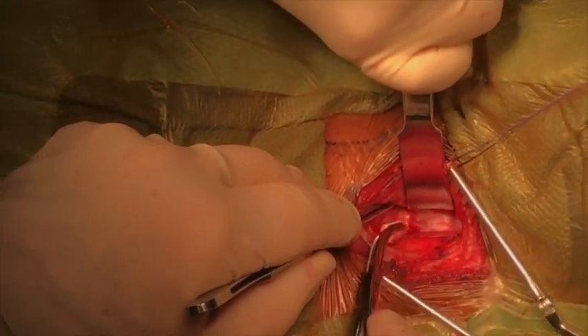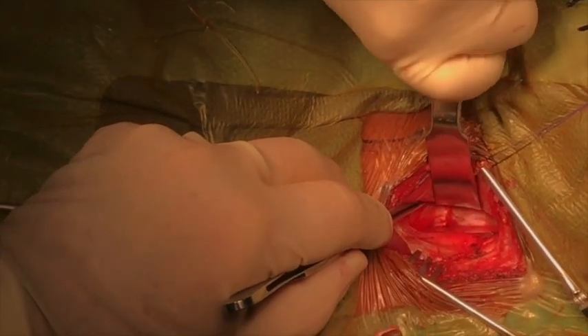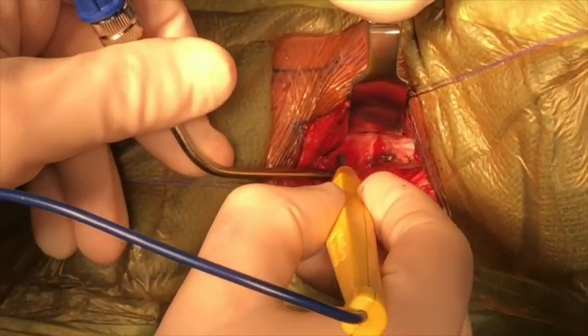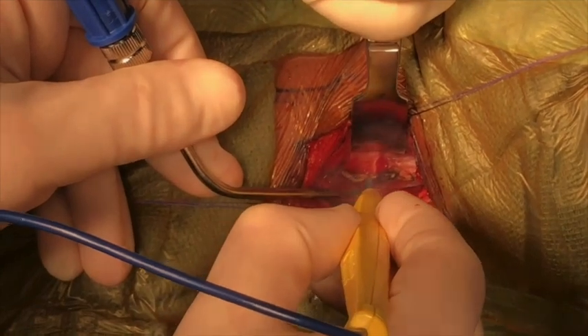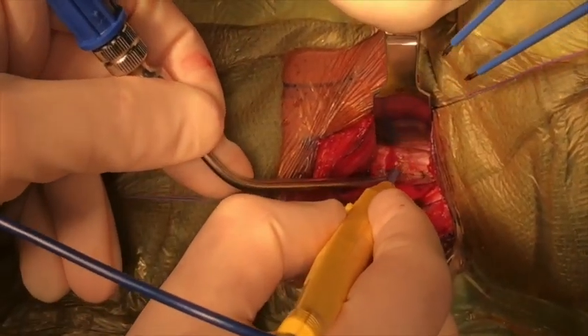After reaching the anterior surface of the cervical spine, the deep cervical fascia was opened and the left and right anterior longus coli muscles were identified. Bipolar cautery at the power of 15 was used to incise at the medial aspect of the left and right anterior longus coli muscles.